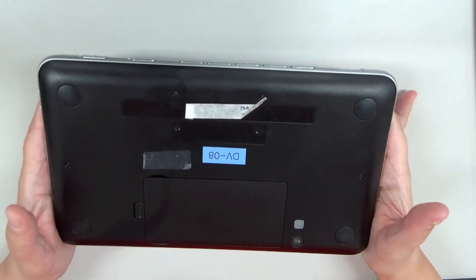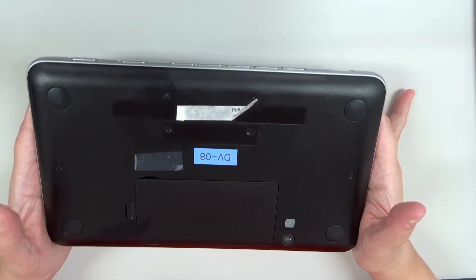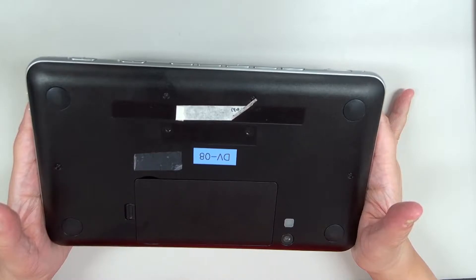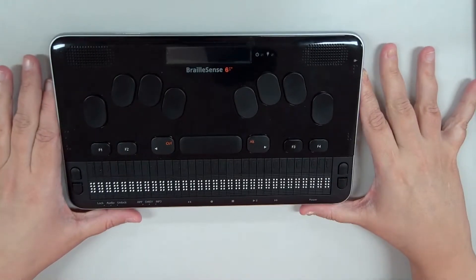The underside of the unit will look very familiar — it contains the camera and the battery compartment. And that wraps up the physical tour, so let's move on to the menus.